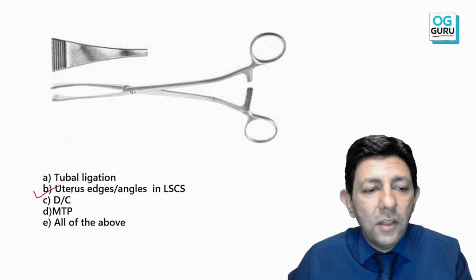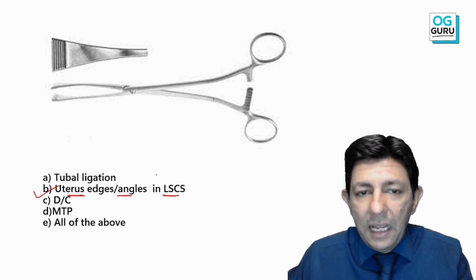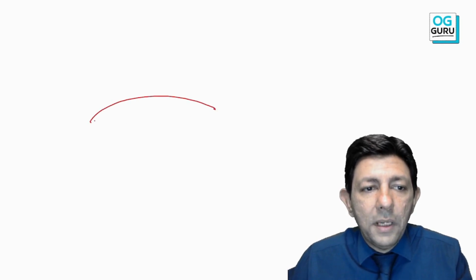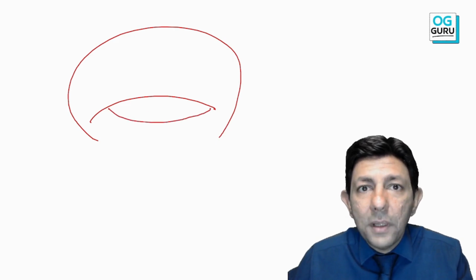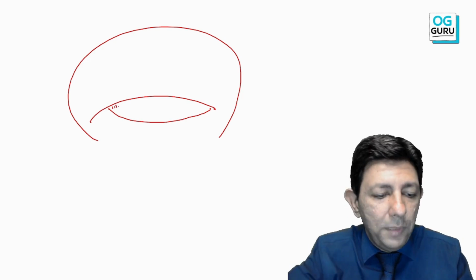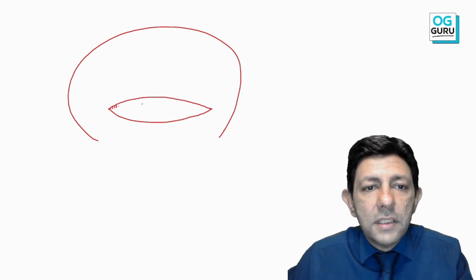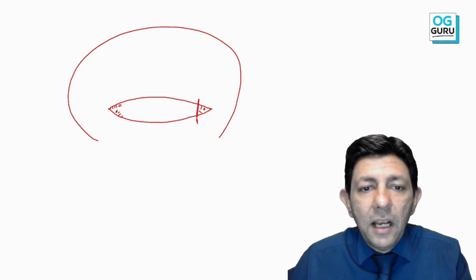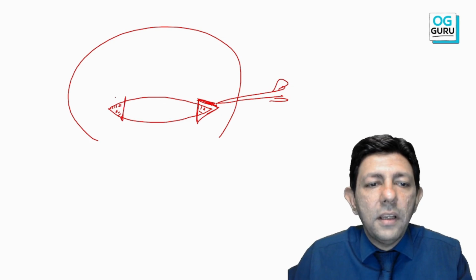It is to hold the uterus edges or angles in LSCS. That means what happens is that when I cut open the uterus, all of you pay attention, this is the uterus, and at the time of cesarean section, when I cut open the uterus, all this part is going to bleed, isn't it? Because I have cut it. This is the incision from where I have delivered the baby. Now all this part is going to bleed, so till the time I start suturing, we are going to apply this instrument over here and over here.